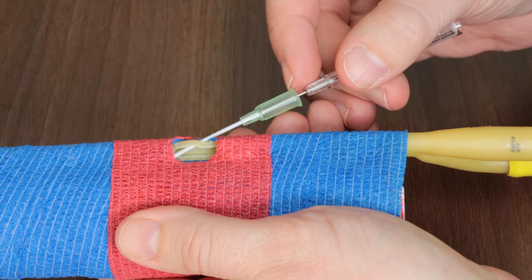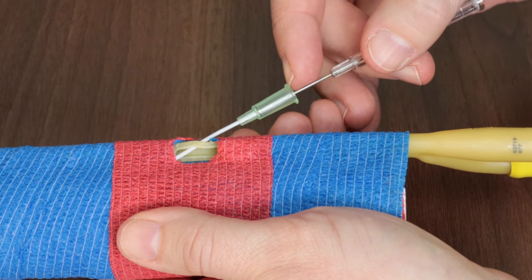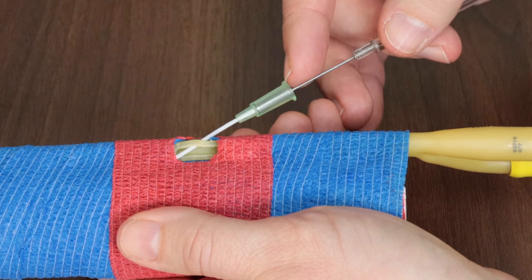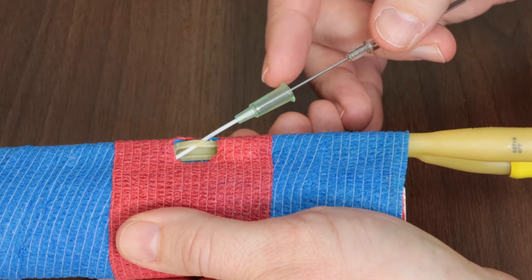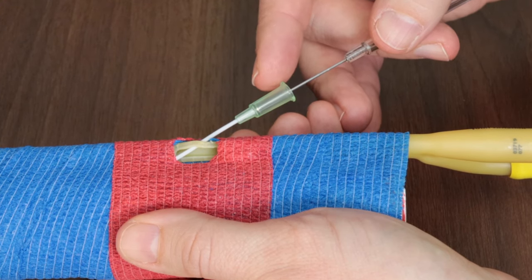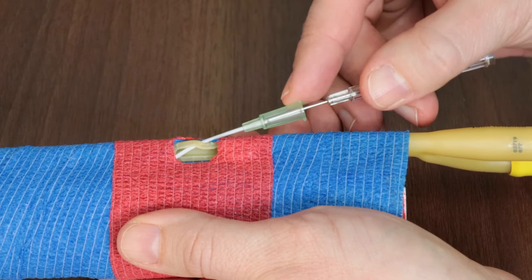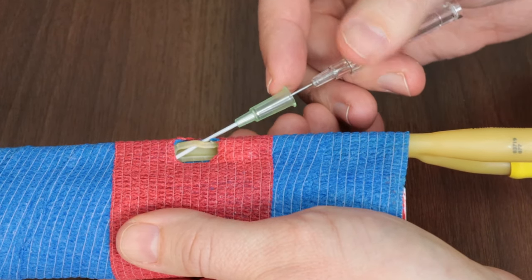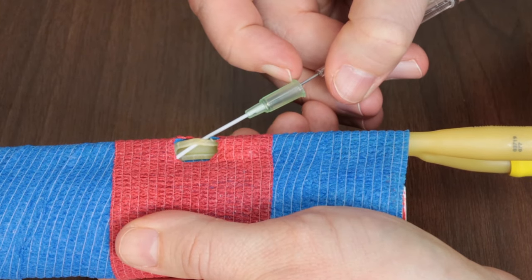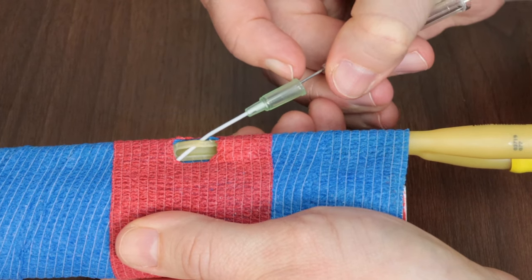What I see a lot with new folks is they'll advance like this. So we're pushing the catheter in, but we're also pulling the stylet out simultaneously. And then once we realize we're maybe not in the same place or we've hit a wall and we're not advancing any further, it seems like the automatic next step is to shove the stylet back in. Don't ever do this. Always pull your catheter back to your stylet rather than advancing your stylet into the catheter.